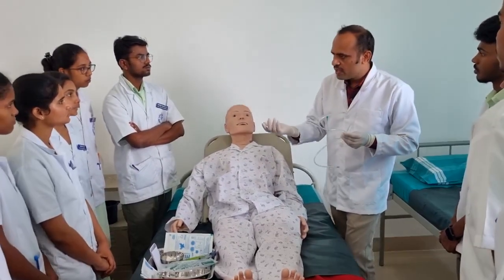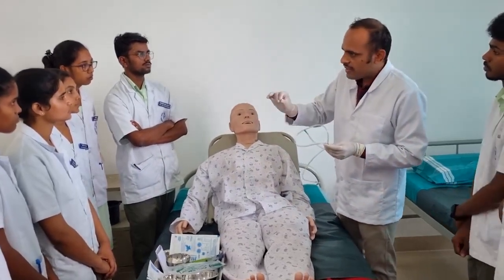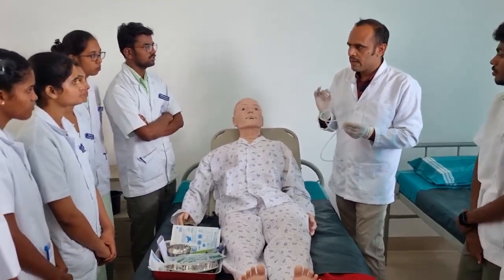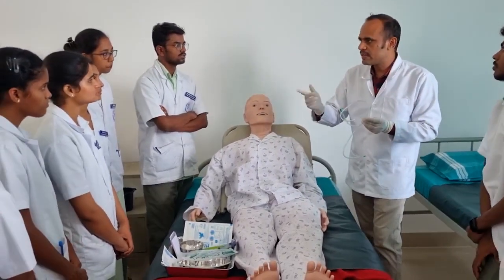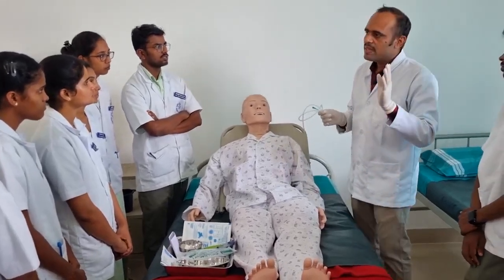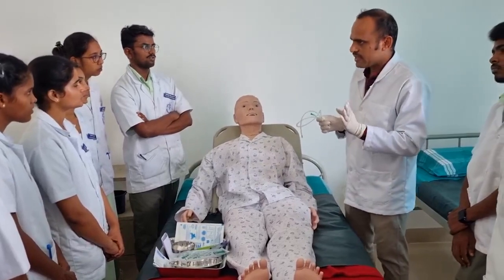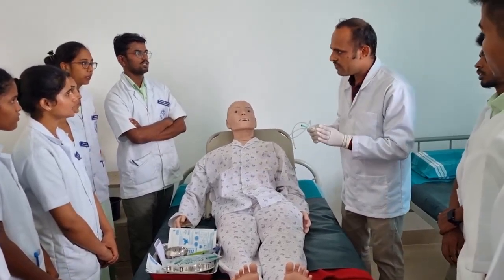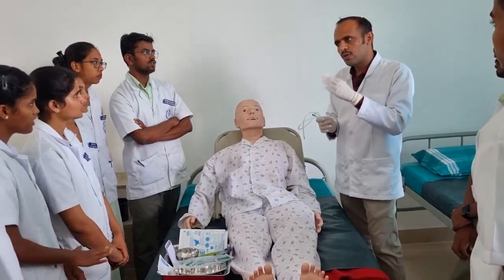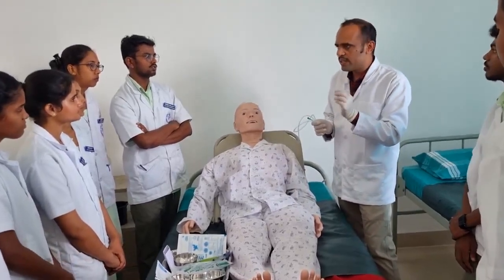In children it is different and in adults it is different in terms of length. In children it will be from 6 to 14 French, and in adults they usually use 16 to 20.